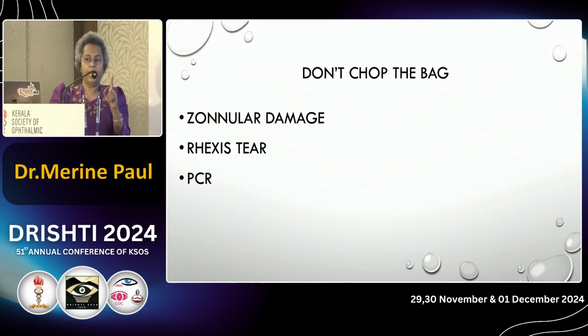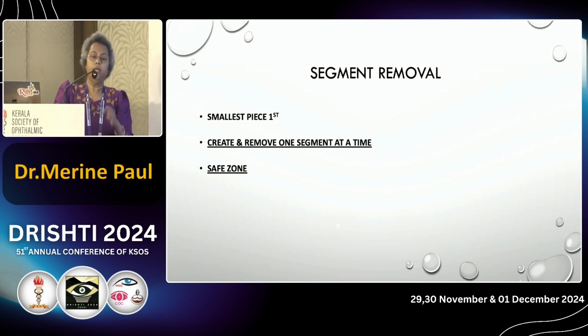Please don't chop the bag. So avoid zonular damage. If you try to chop on the bag, the zonules there will get disturbed. There can be a rhexis tear and, of course, the most dreaded, the PCR.